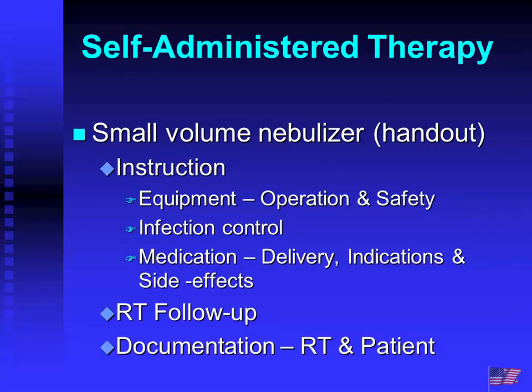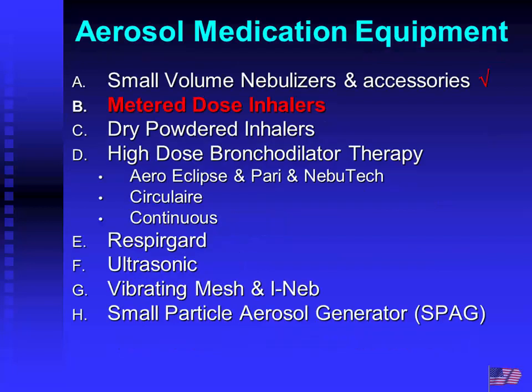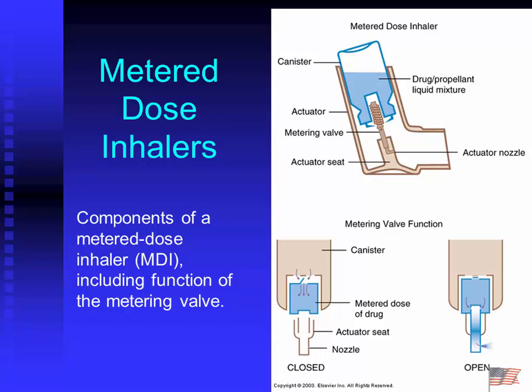So again, if they're using a small volume nebulizer, like we talked about, it could also be that they're just using a metered dose inhaler also. Speaking of which, let's move on into the metered dose inhaler. I know Lori's covered a little bit about this as far as the design of the internal component, how when an actuator seat moves as we compress it, it releases the medication through the nozzle and allows for inhalation to occur.